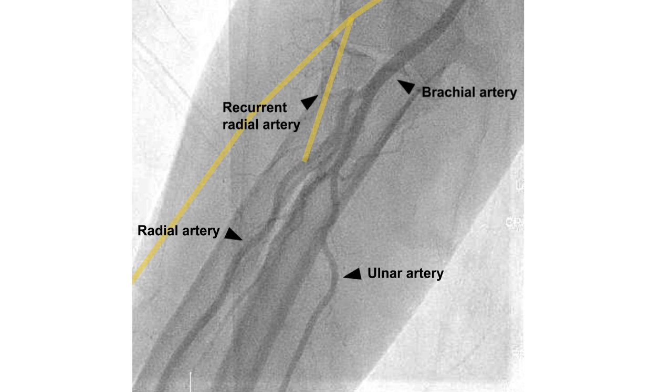The yellow-colored lines show the outline of the radial nerve. The superficial radial nerve runs towards the superficial parts of the forearm and is purely sensory, whereas the posterior interosseous branch of the radial nerve runs deep into the muscles to innervate the majority of hand extensor muscles.